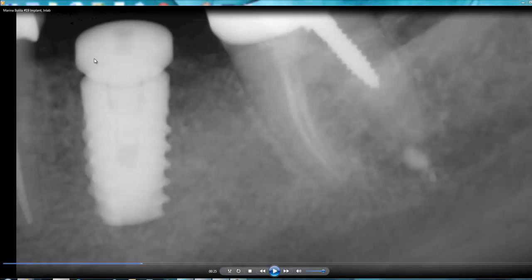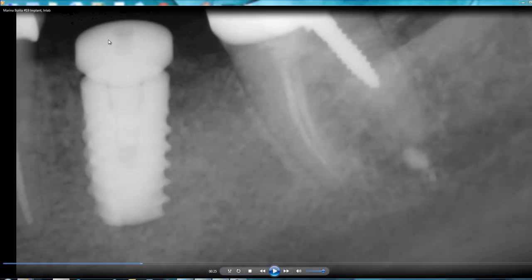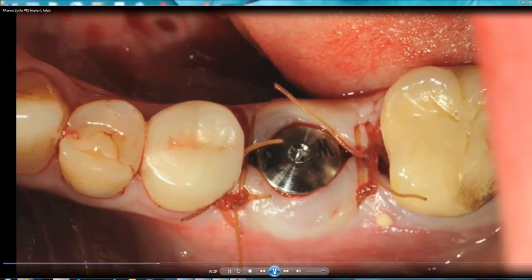I placed the healing cap. You can see a little V-shape on each side of the implant — that's because it's designed with a platform switch. We then put the surgical healing cap in place and completed a two-stage surgery at the same appointment, and put the stitches in.